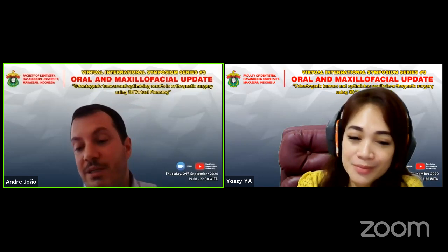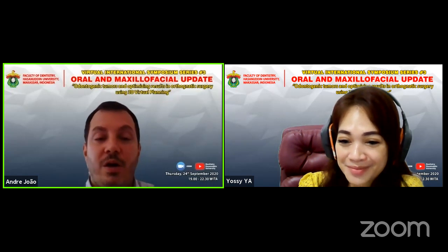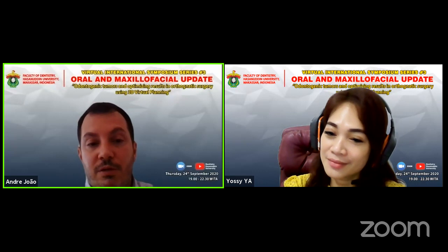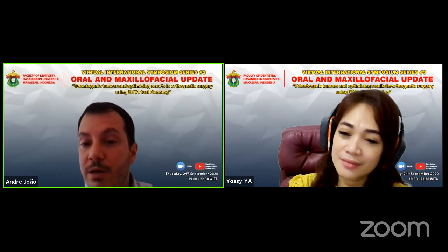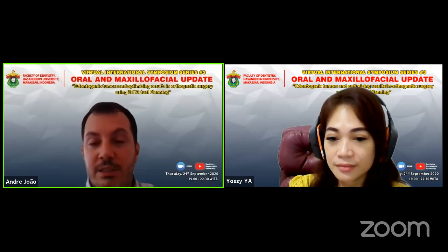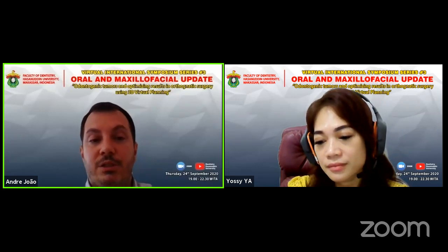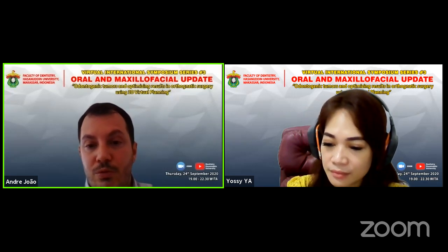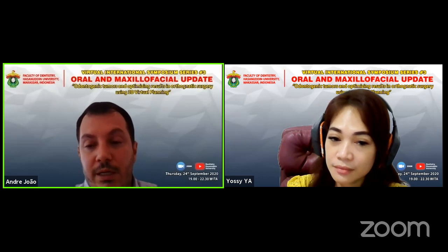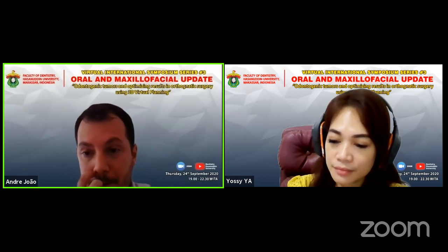So sometimes the patient says, I don't like my bite, and then you say, oh, you should do this surgery. It's going to take 1.5, 2 years of treatment. Nobody wants it unless you show them why you are suggesting this treatment. And this software is a very nice tool to show this patient what you're planning.